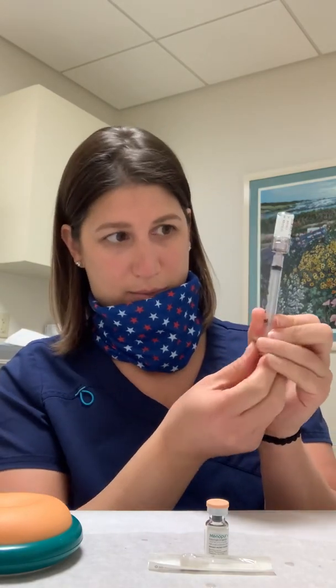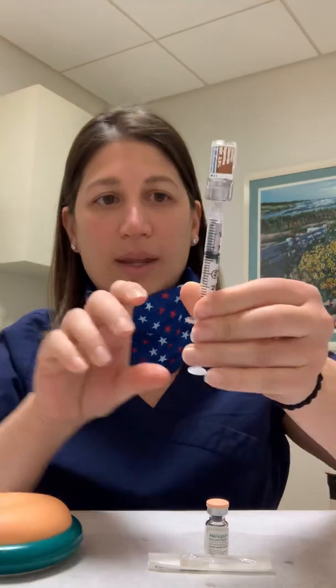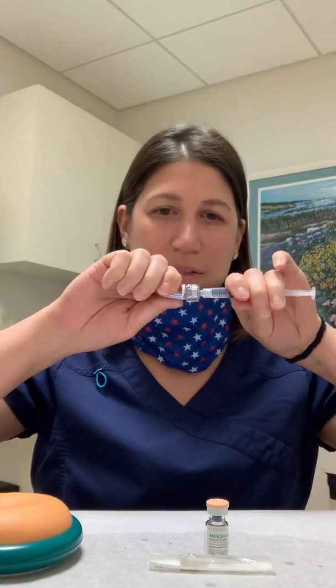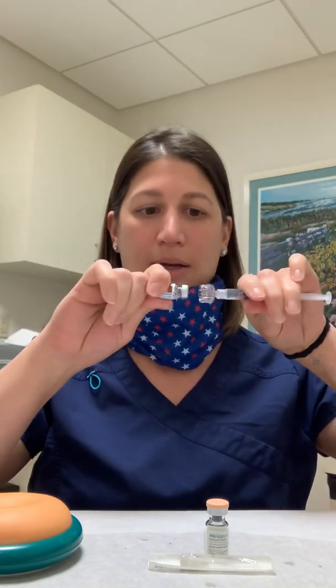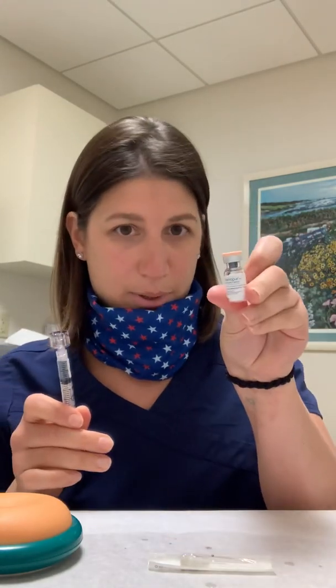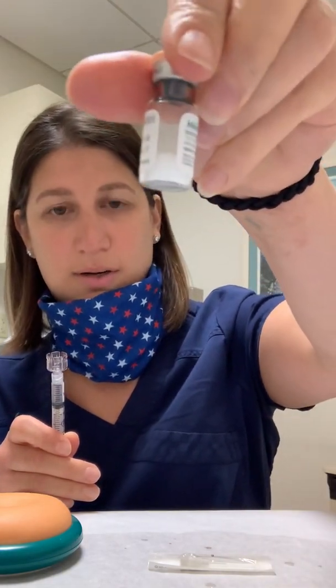You're going to turn it upside down, push the air all into the vial, and then pull out past the 1. If there are any tiny air bubbles, you can flick them out, and then just push up to that 1. Once you have your 1cc of fluid, hold the syringe and pull this glass vial straight off, leaving the Q-cap on. The vial comes on and off very easily. Now you have 1cc of fluid. You're going to go to your Menopur vial — it says Menopur on it, has a peach cap, and has a chunk of powder in it.